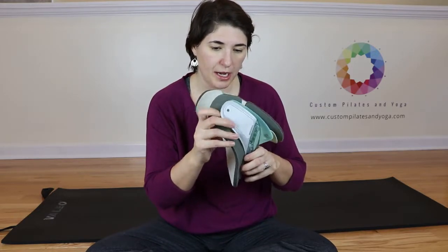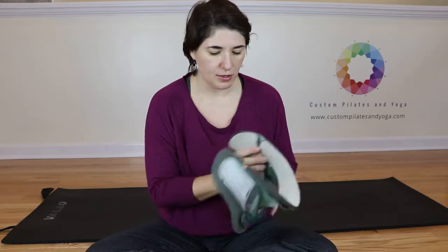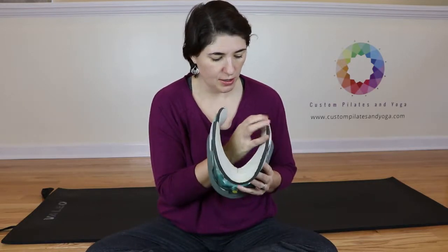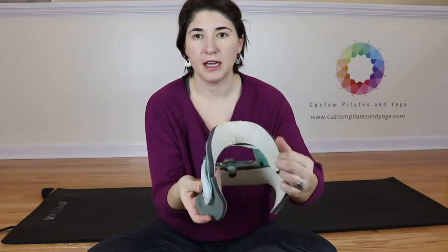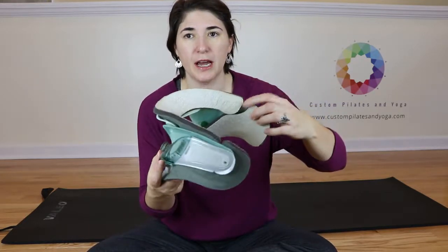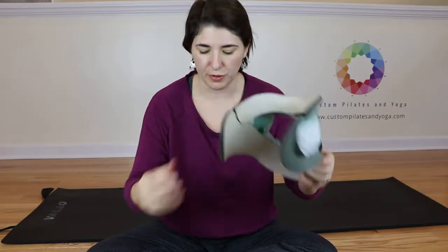And then you'll notice as you come on out, that this sort of snugs right up by the inside of that top piece. I've got a little bit of a gap over here on this side, but this piece is all nice and flush and beautiful.